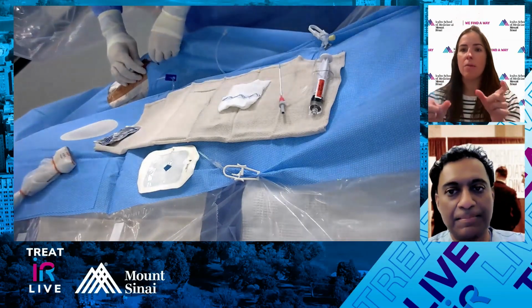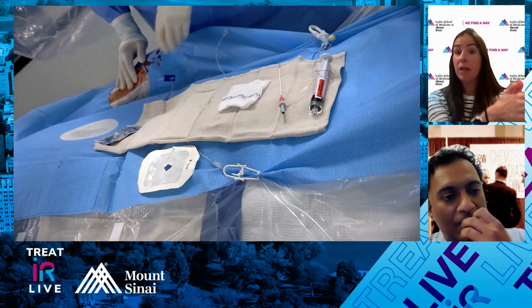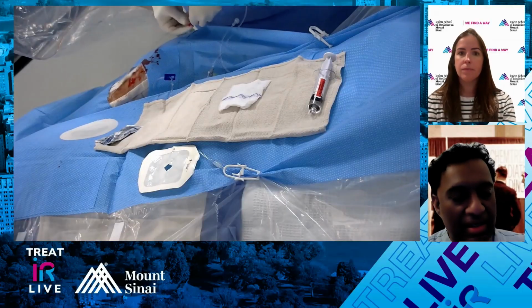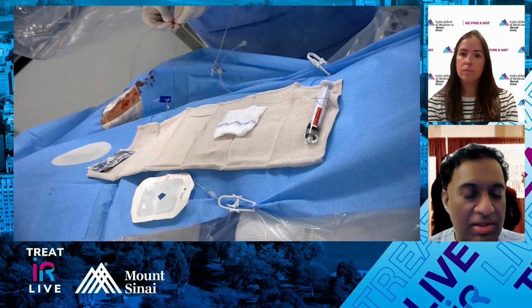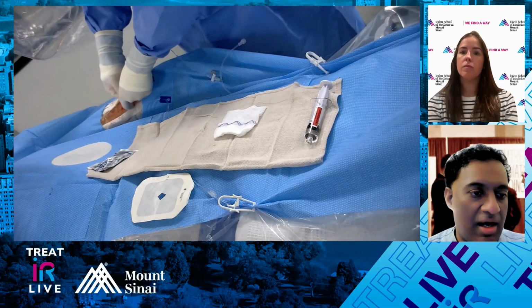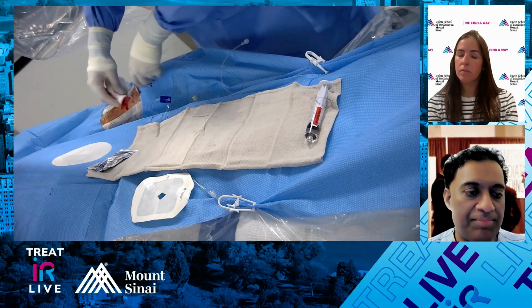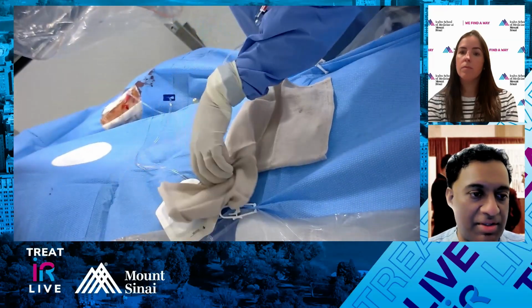Goegy, can you talk about that a little bit more? The options we have here. So here, it looks like the plan is to do a staged approach, but then you're talking about an iliac branch device. Can you give us the options and run us through them? Yeah. So again, I think hypogastric embolization is fairly safe, especially if you stay proximal to the anterior posterior division. They will probably have some buttock claudication, up to 40%. Pelvic ischemia is a possibility, but low likelihood. And again, pretty well tolerated. I've even done staged bilateral hypogastric embo, so I think it's very reasonable.